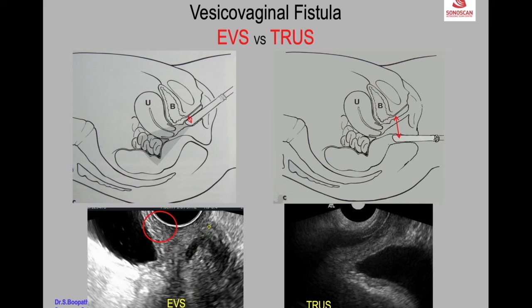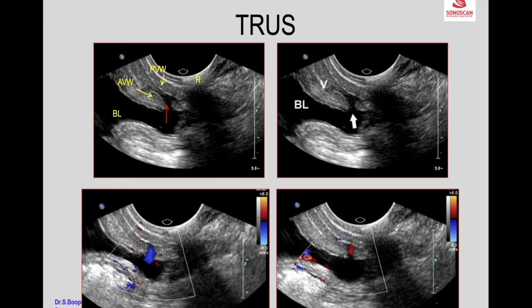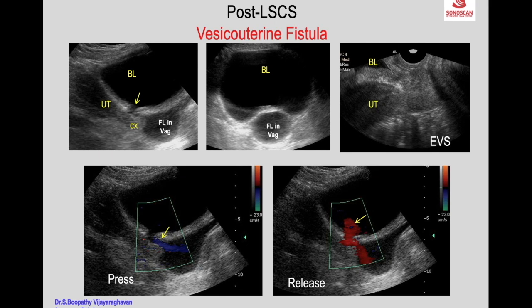That is the thickness of tissues seen in vaginal scan versus transrectal scan. In transrectal scan you can identify the rectum, the bladder wall, with the posterior vaginal wall intact and fluid in the lumen of the vagina. The rent is easily seen in transrectal ultrasound, and when you use color Doppler with press-release you see blue then red again, confirming the fistula is well delineated on color Doppler as well as grayscale.